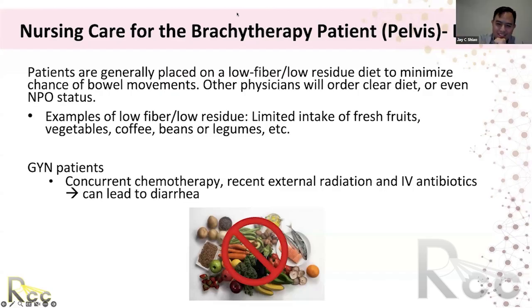Thanks. Yeah, that makes sense. And yeah, the movement aspect we worry about too, because we have had nurses in the hospital that have rolled the patient and our applicator has moved, which is concerning from a radiation delivery standpoint, but also laying flat the whole time is not ideal for the patients too. So that's definitely a point of controversy.